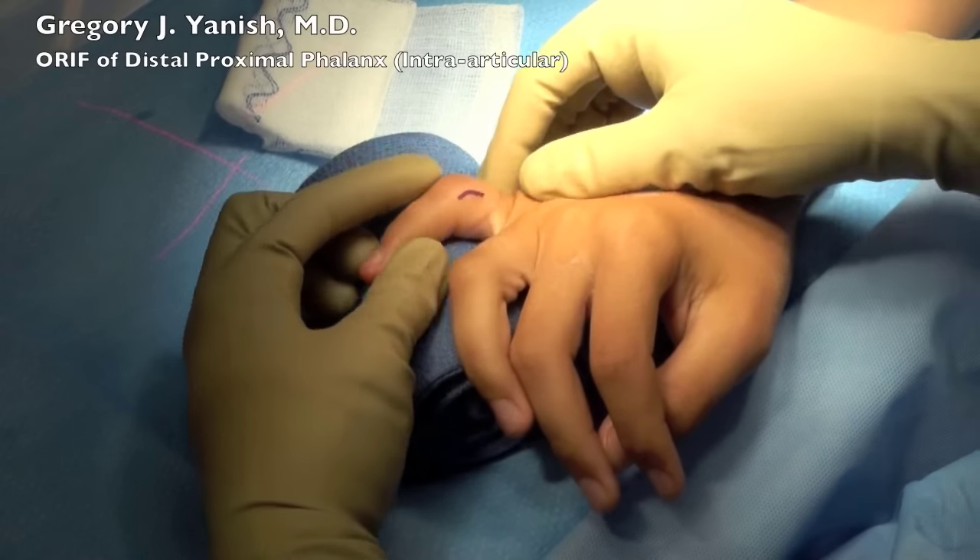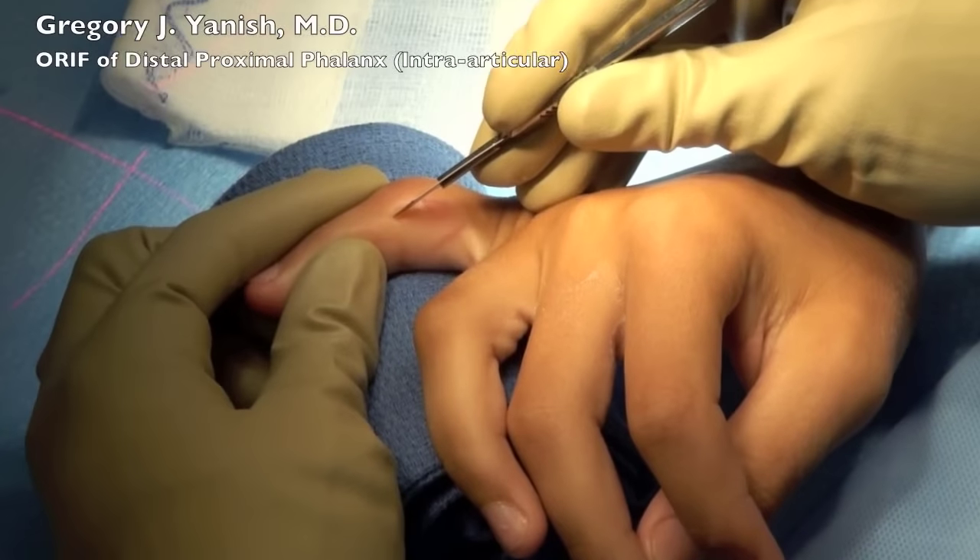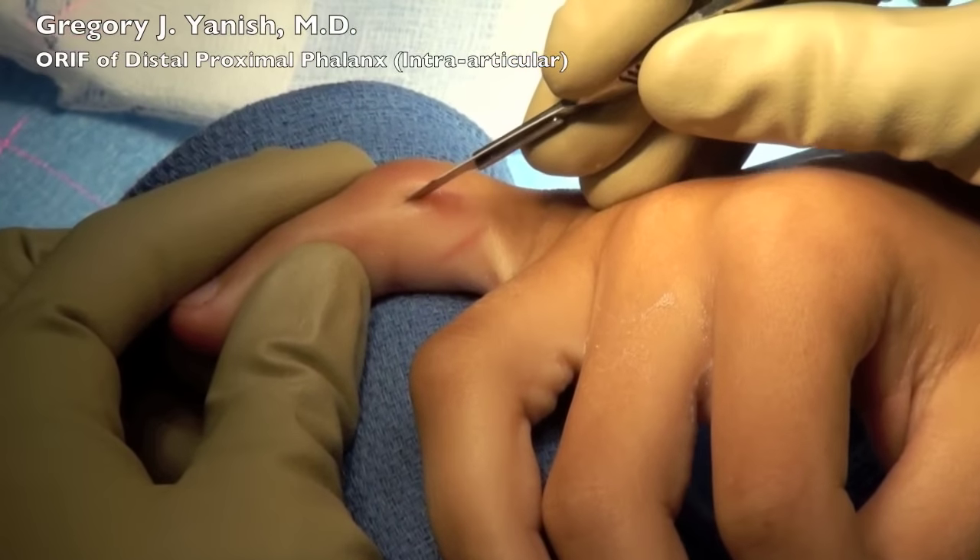At this point, we've marked the skin incision with a skin marker as usual, and the skin is incised with a 15-blade scalpel.